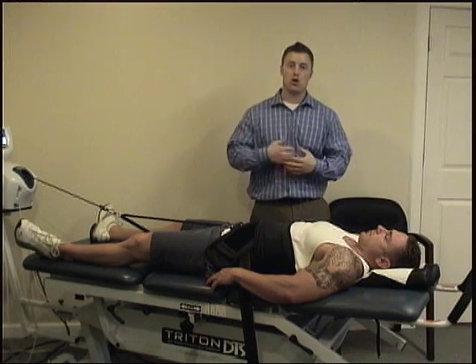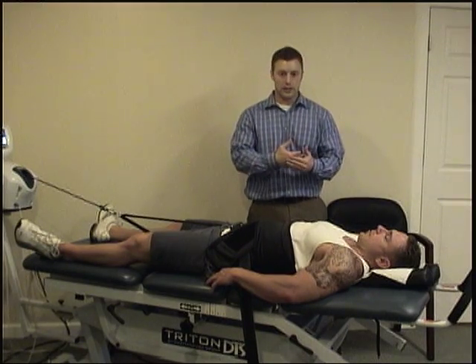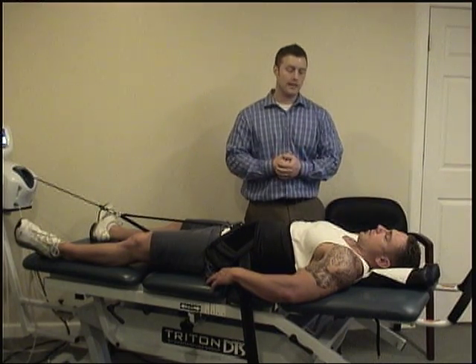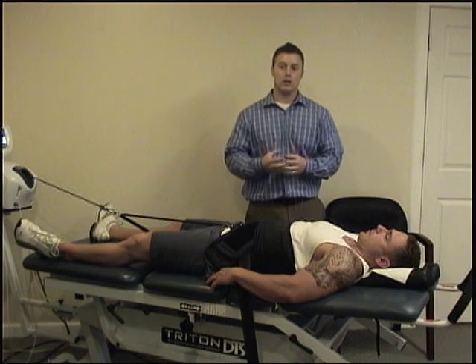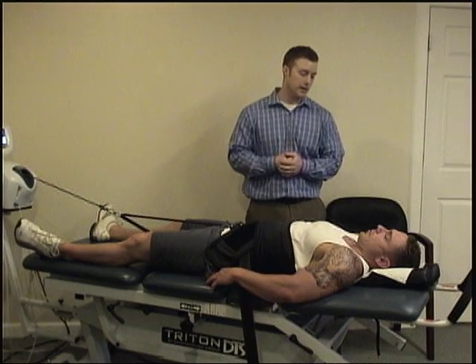Working at a computer — all those things add up over time. So what it's doing now is just slowly and gently stretching out the low back, taking the pressure off of the disc, allowing fluid and nutrients to suck into the disc, thereby rehydrating the disc.